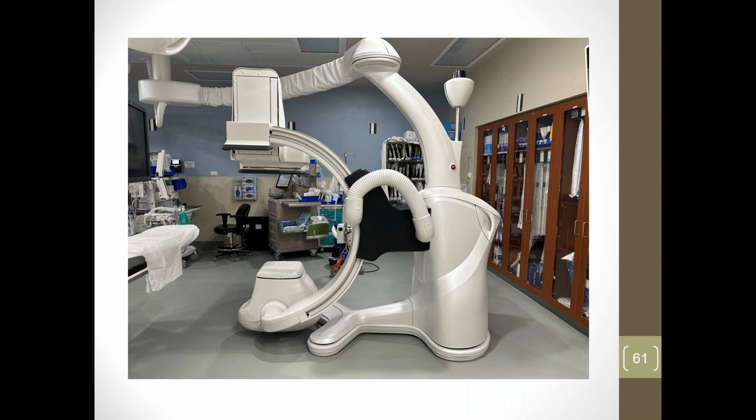And then here's another shot of a hybrid OR. Again, the robot can move around the room, so you can get some really cool shots and angles that you wouldn't be able to with a conventional, fixed lab.